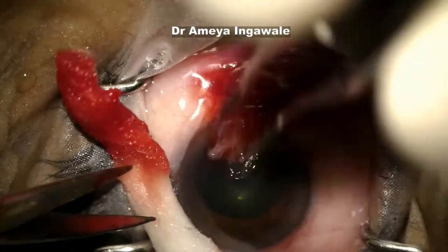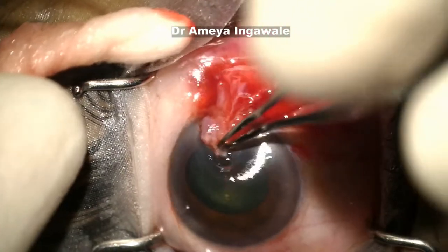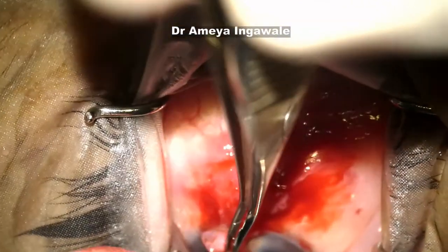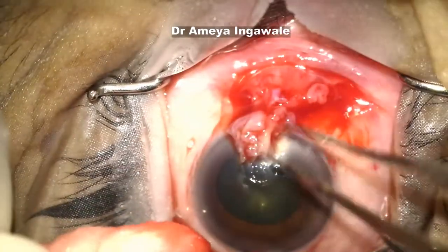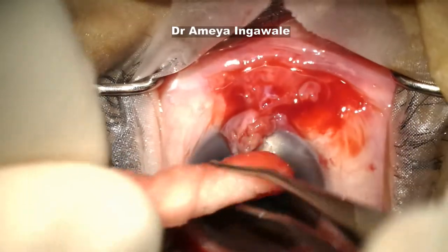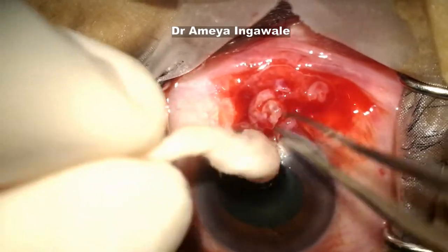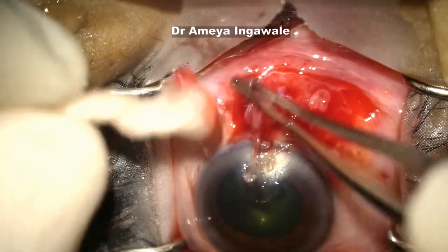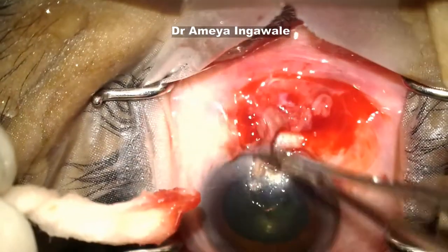I am removing the head of the pterygium using avulsion. When using avulsion, it is a good idea to use force towards the center of the cornea rather than moving it away towards the limbus. If you move the head of the pterygium towards the center of the cornea, it usually does not leave any tags. So even though this is a pretty tough pterygium, it is coming off without leaving any tags. It is pretty difficult to smooth those tags if you let them form, so prevention is better than cure.